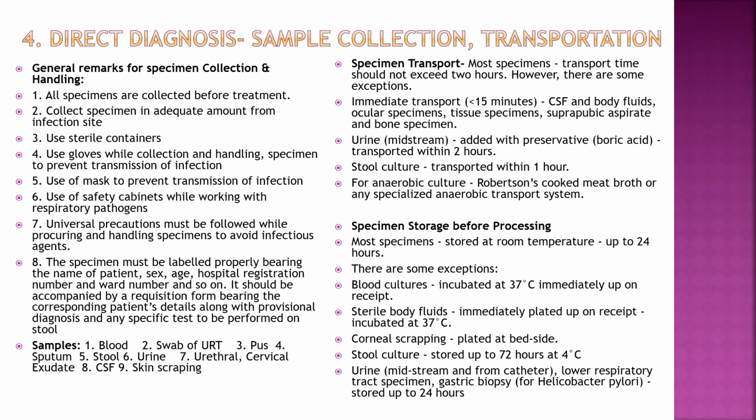Specimen transport. For most specimens, transport time should not exceed 2 hours. However, there are some exceptions. Immediate transport within 15 minutes for CSF and body fluids, ocular specimens, tissue specimens, suprapubic aspirate, bone specimen. Urine with preservative like boric acid is transported within 2 hours. Stool culture is transported within 1 hour. Anaerobic culture is transported in Robertson cooked meat broth or any other anaerobic transport system.